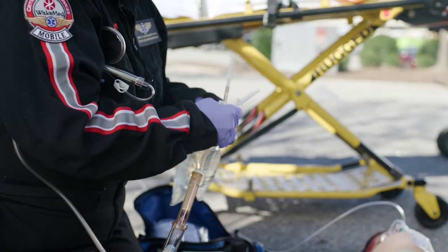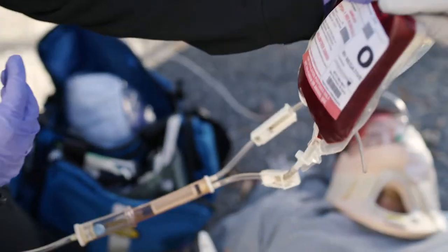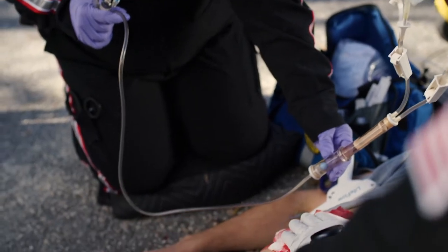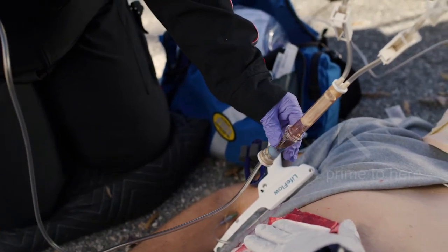The first step is to close the clamps and spike both bags. Next, open the saline clamp. Squeeze the middle of the air check to prime both chambers and continue squeezing until fluid is at least halfway up the blood filter.